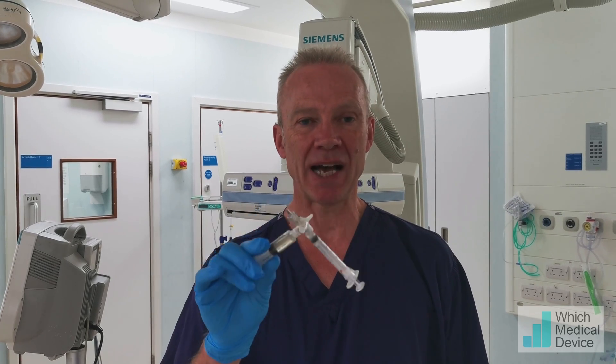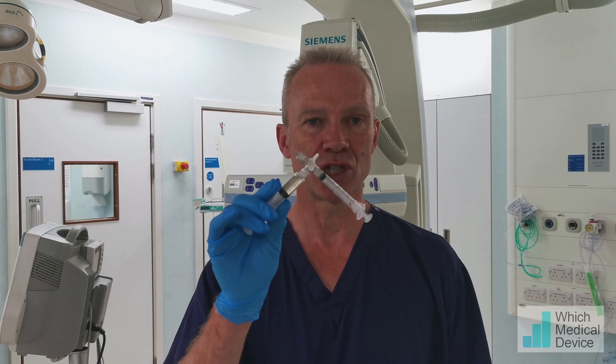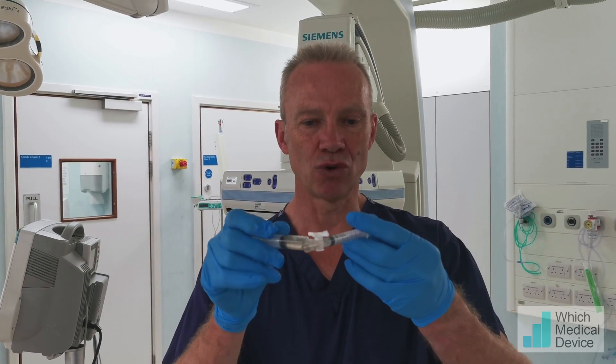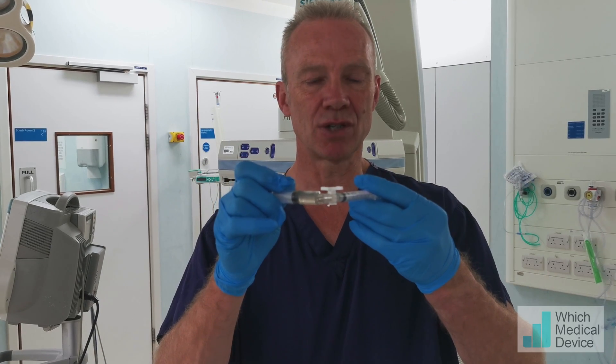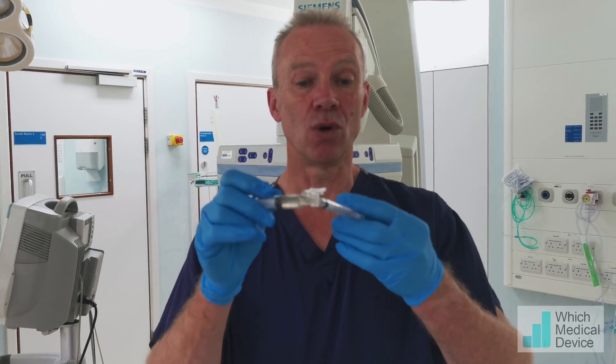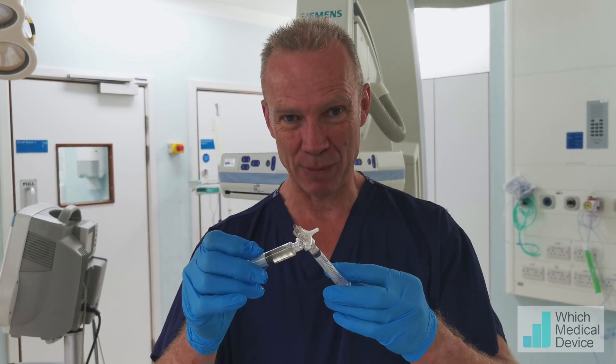We did one side, came back and got the same mixture to do the other side. You can see what the lipiodol has done to the syringes — it's actually destroyed the plastic, which is why we use specific syringes, or why you should use specific syringes and taps with lipiodol.